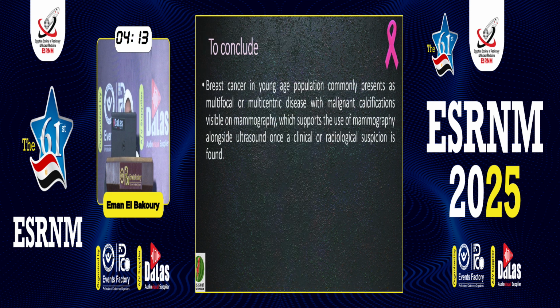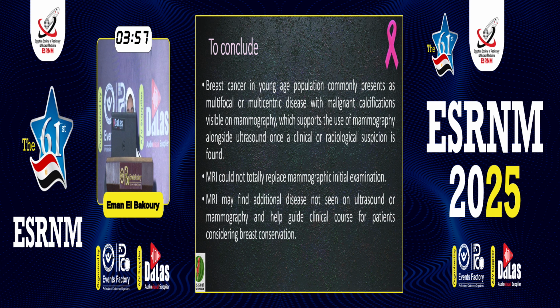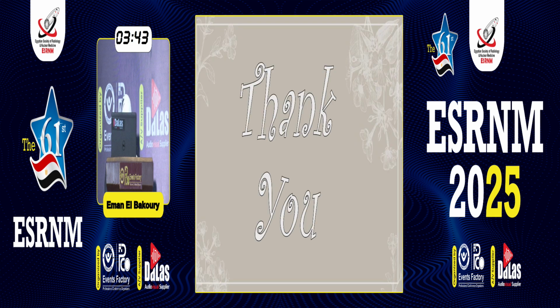So to conclude, the breast cancer of the young population commonly present with multifocality and multicentricity with malignant calcification that support the use of mammogram along the ultrasound. The MRI couldn't totally replace the mammogram at initial examination, so do mammogram please. The MRI may find additional disease that's occult in the ultrasound and mammogram, and it also may help to guide the clinical course and the treatment of the patient. And thank you.